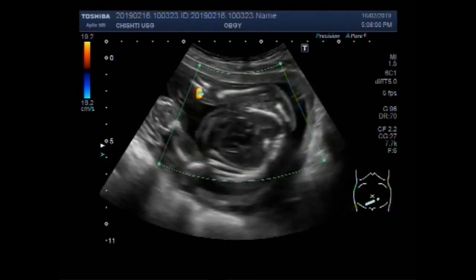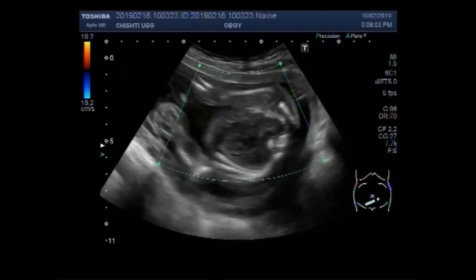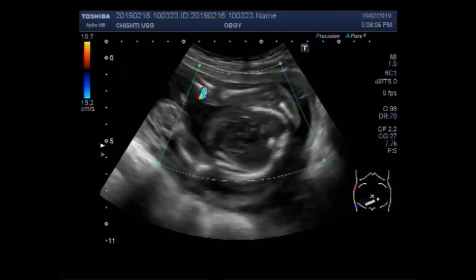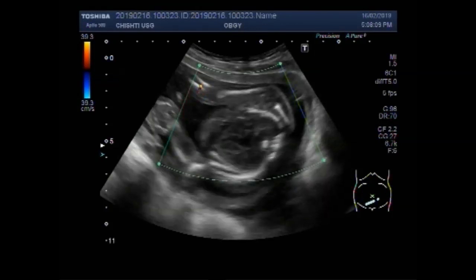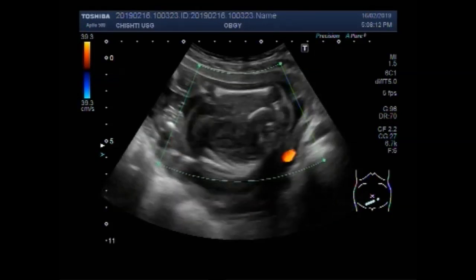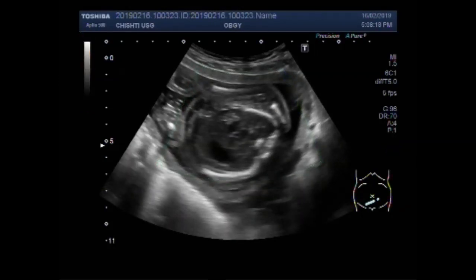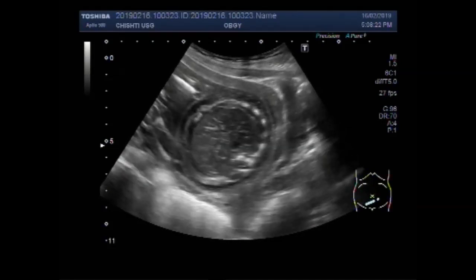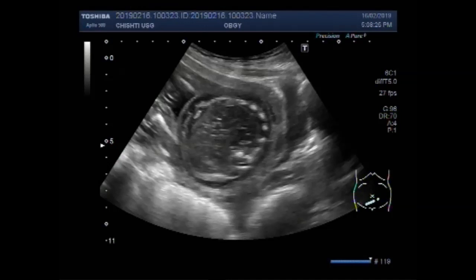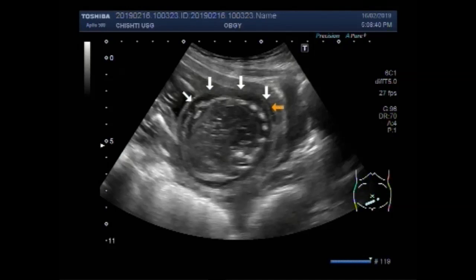Next part is the fetal body. Now you can see the soft tissue edema on the fetal abdomen. This is soft tissue edema.